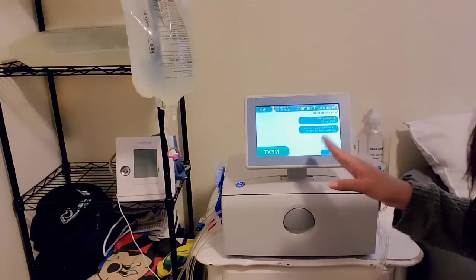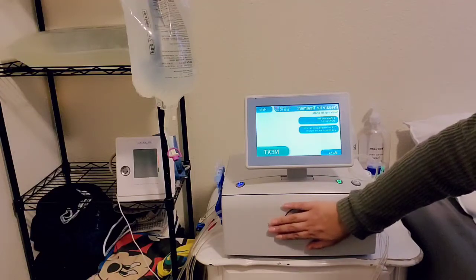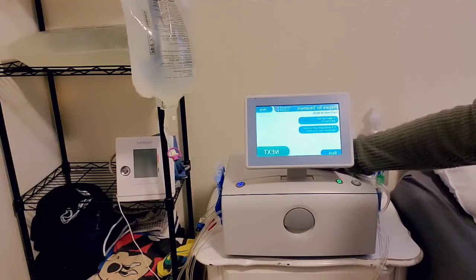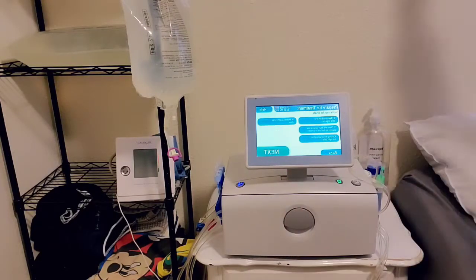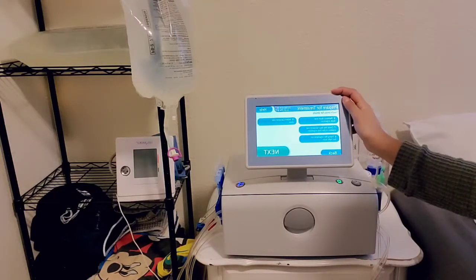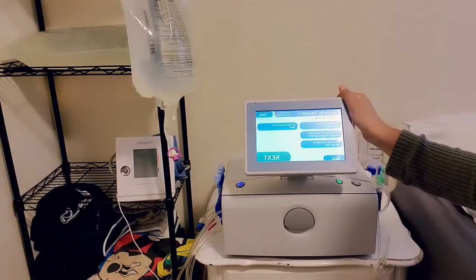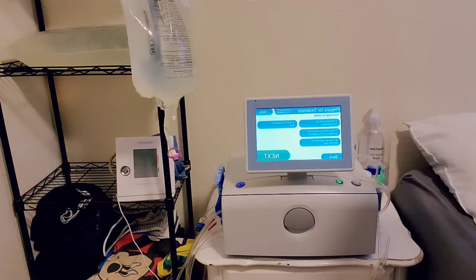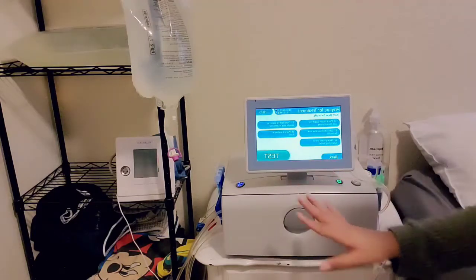The machine is asking you to put the cassette in and place the heater bag in the heater at the back. The screen shows step-by-step instructions for installing the cassette, so you won't be completely helpless the first time — your nurse will also walk you through it. Now it's telling you to test after you connect everything.